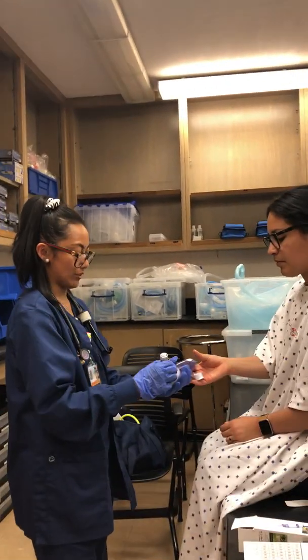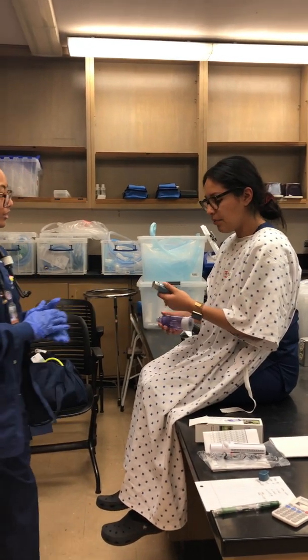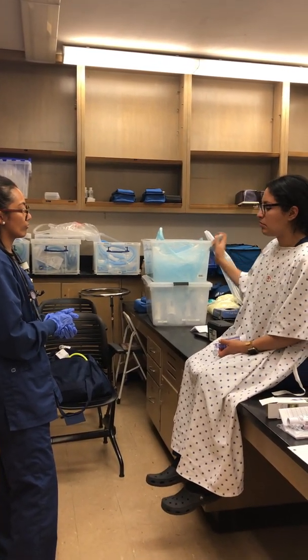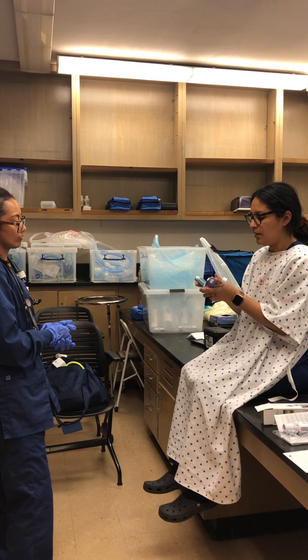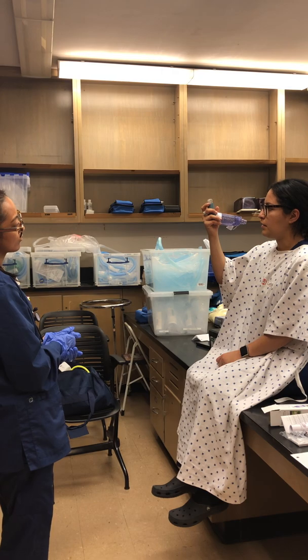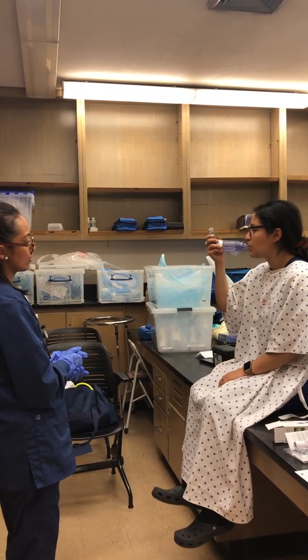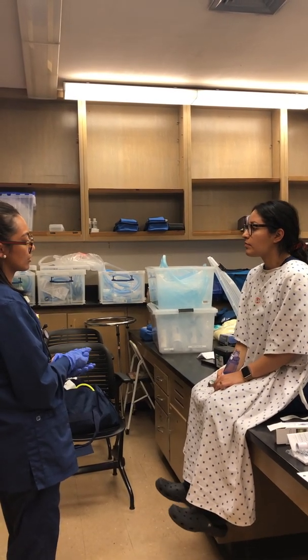So let me go ahead and remove this for you. Okay, so we're going to start with you explaining priming. Okay, priming. I'm gonna shake it up and warm it up, and then spray it, and then put it back on the spacer, and then I'll make sure my head's tilted back, and then make sure I coordinate the pressing of this with my inhalation. Okay, so I'm gonna exhale first, and then. And hold for 10 seconds at least.